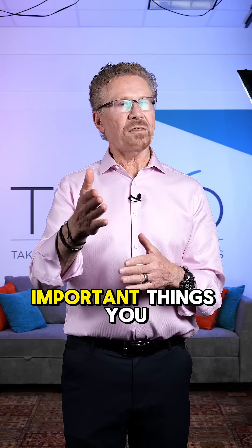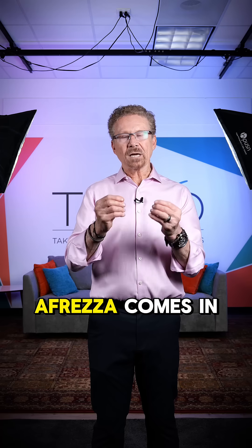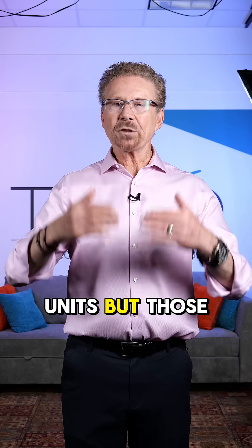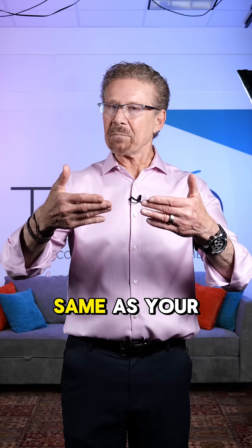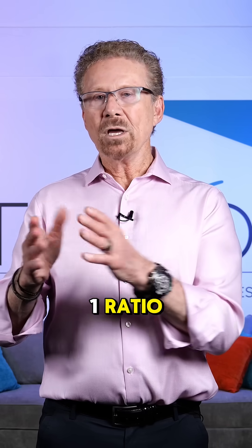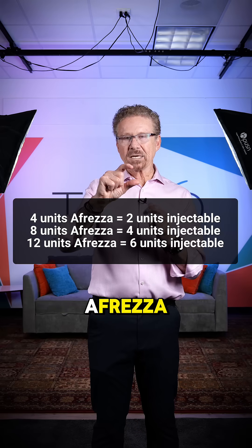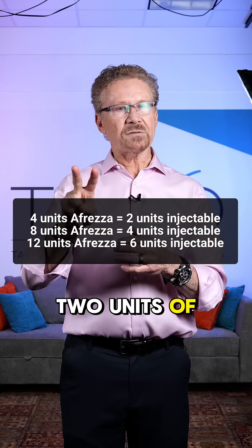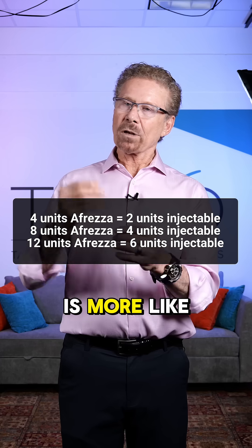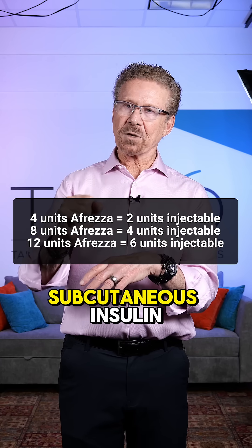This is one of the most important things you need to know. Afreza comes in cartridges that are four, eight, and 12 units, but those doses are not the same as your subcutaneous doses. It's more of a two-to-one ratio, so the four-unit cartridge is more like two units of subcutaneous insulin, and the eight-unit cartridge is more like four units of subcutaneous insulin.